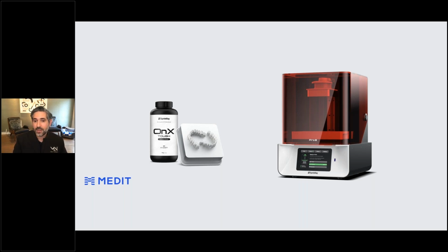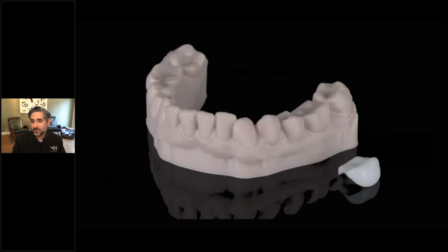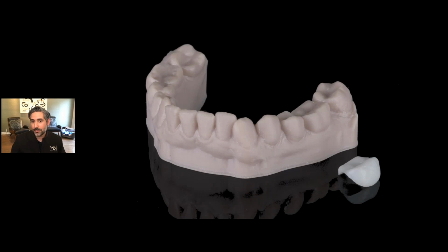So I went ahead and I printed this shell ahead of time. And so what I have ready for the appointment is the model as my backup in this case, and the provisional shell, which I thought I would reline.